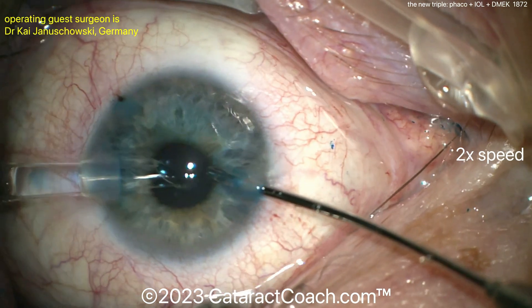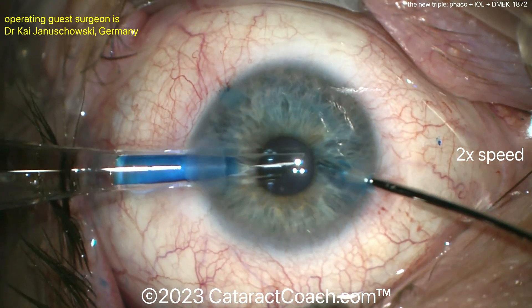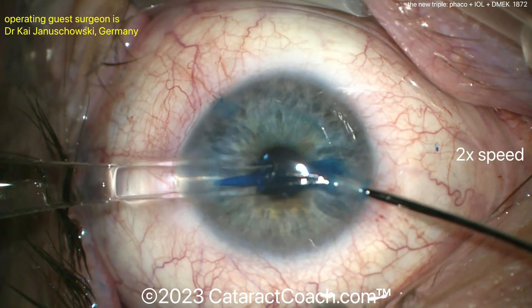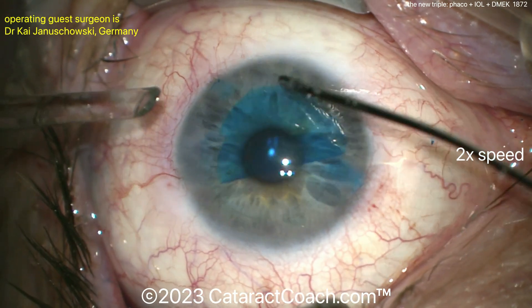Here comes the graft. Looks like it's already pre-loaded on some sort of delivery device and just gently placing it in the eye. On the other hand, a little forceps — maybe going to grab the very edge of it to help position it. Oh no, just a BSS cannula. And there you go — tap, tap, tap.